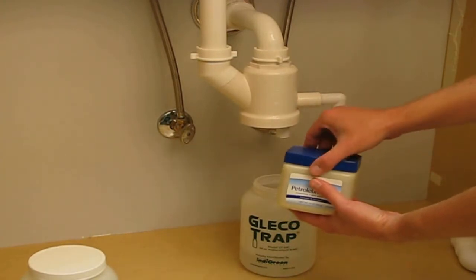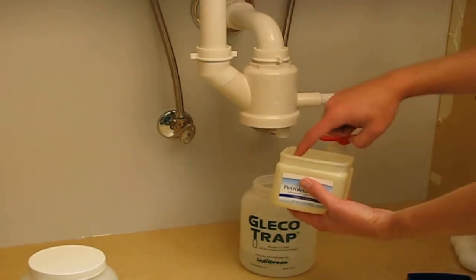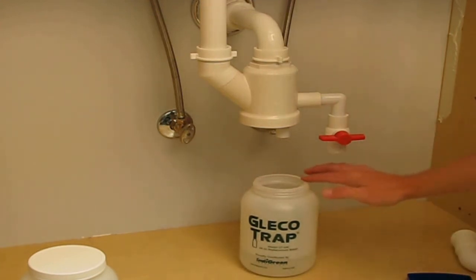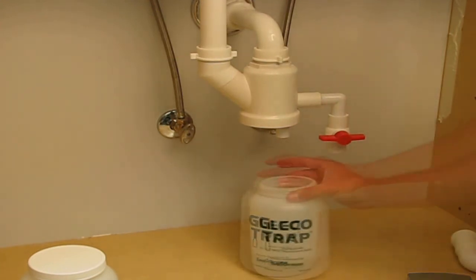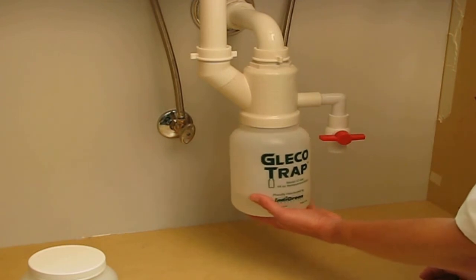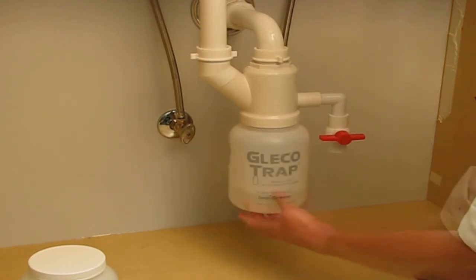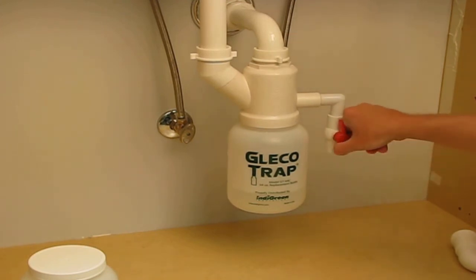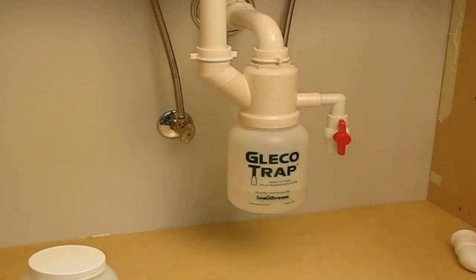It's recommended that each new bottle be coated with a thin coating of petroleum jelly. This allows each new bottle to properly seal against the gasket on the inside of the housing. Next, place the new bottle under the housing and screw it into place. Remember to turn the red handle back to the closed position. That's it — a complete trap change in less than 90 seconds.